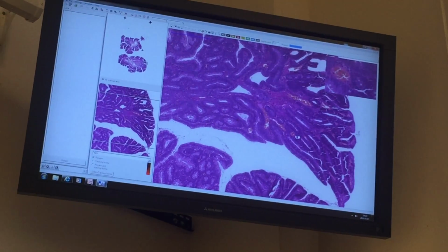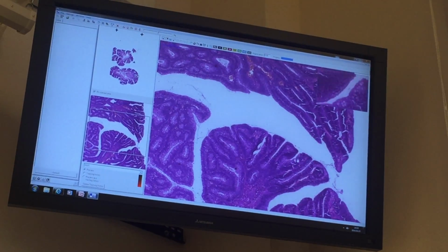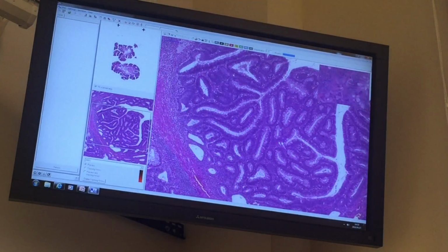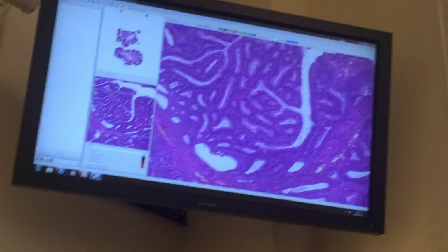Miss, I have a question. How do you know if it's villous? I know, these are the villi, these parts. And how would the tubular look? Isn't it almost like these parts, and it's not so thin? And the same place has both? Yes.